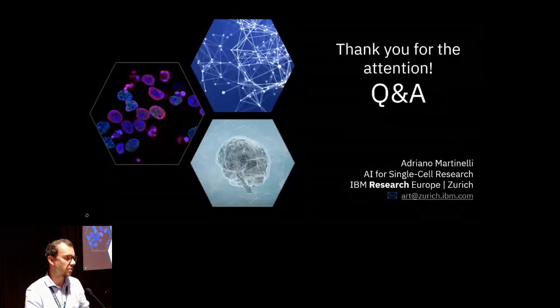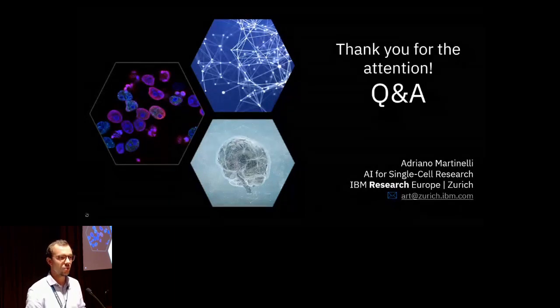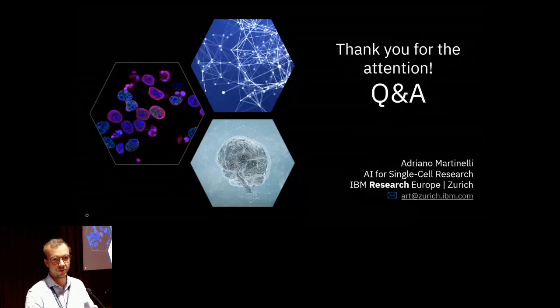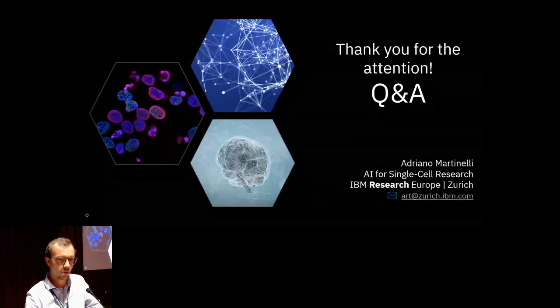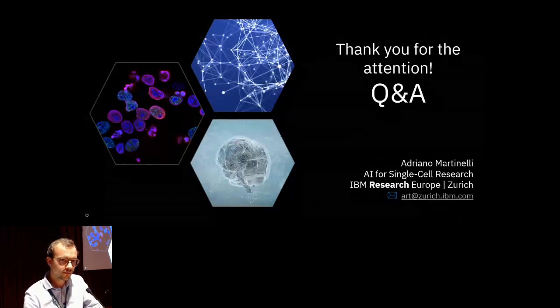So we do not recommend to use a certain graph structure per se, but there are some types of scores like the infiltration for which you should use, for example, a radius graph, just because of the way it computes the infiltration for each single cell. It's better if it has some more neighbors than just the ones that are in contact with each other. But per se, we don't suggest to use a certain score. And I think it also depends on the biological question you have, right? And in terms of benchmarking, I did not really benchmark the difference between the scores based on the different graph topologies yet. I think that would be an interesting question.